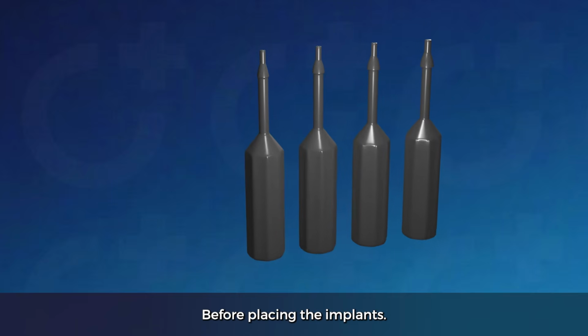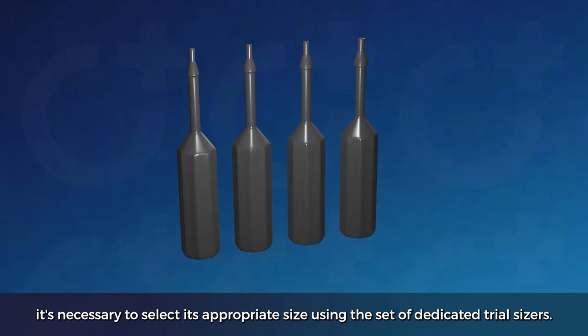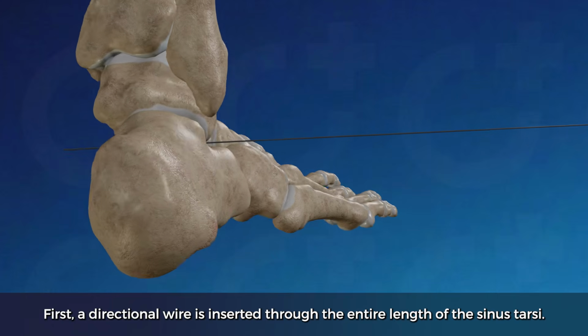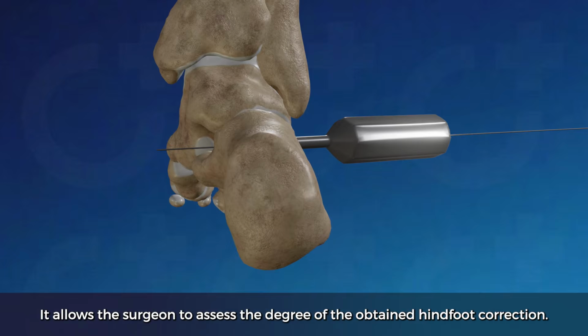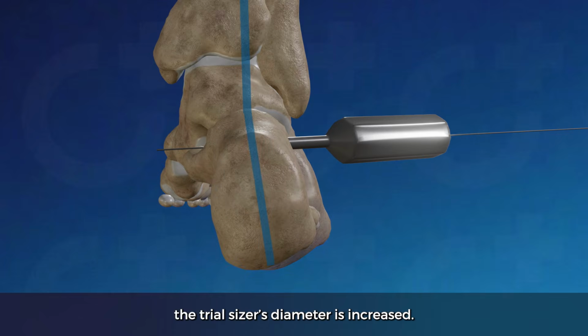Before placing the implant, it's necessary to select its appropriate size using the set of dedicated trial sizers. First, a directional wire is inserted through the entire length of the sinus tarsi. Then, a trial sizer is inserted into the sinus tarsi. It allows the surgeon to assess the degree of the obtained hindfoot correction. If there is still excessive calcaneus eversion, the trial sizer's diameter is increased.